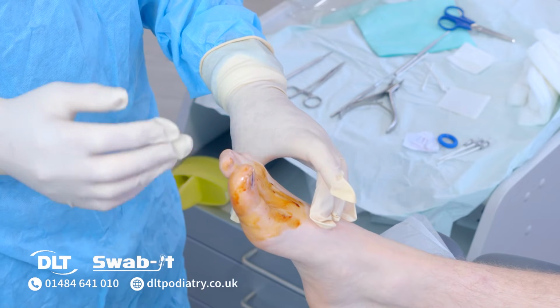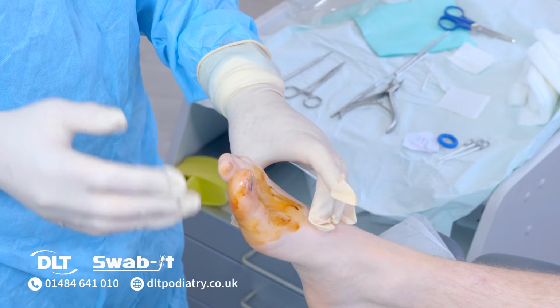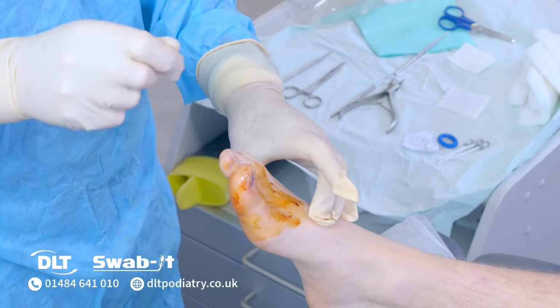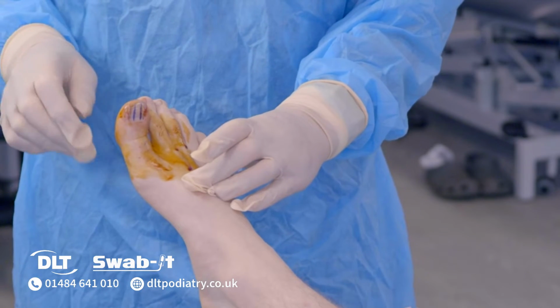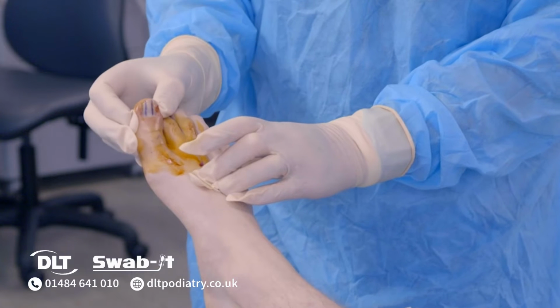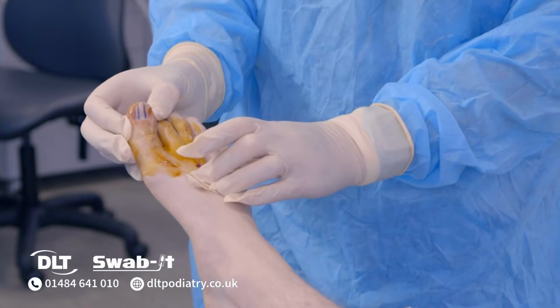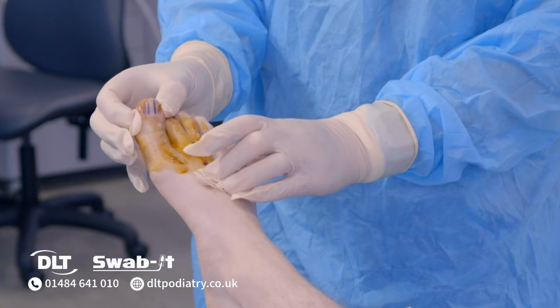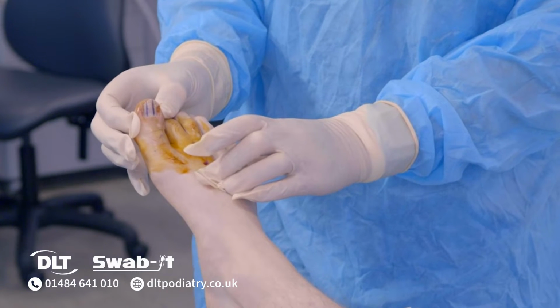The patient wants a total nail avulsion, but for the purpose of this presentation, we're just going to talk through how you would do a wedge resection. We've drawn on the nail what it would look like, and it's clear to see that there will be little point in doing another bilateral wedge resection, which was the previous failed procedure.